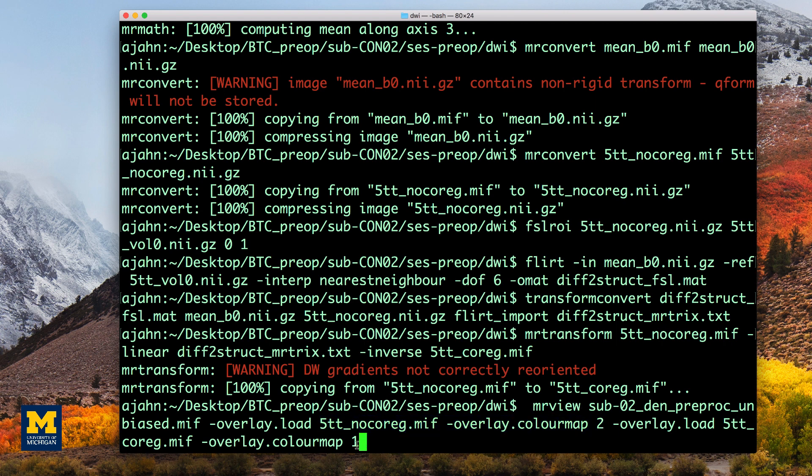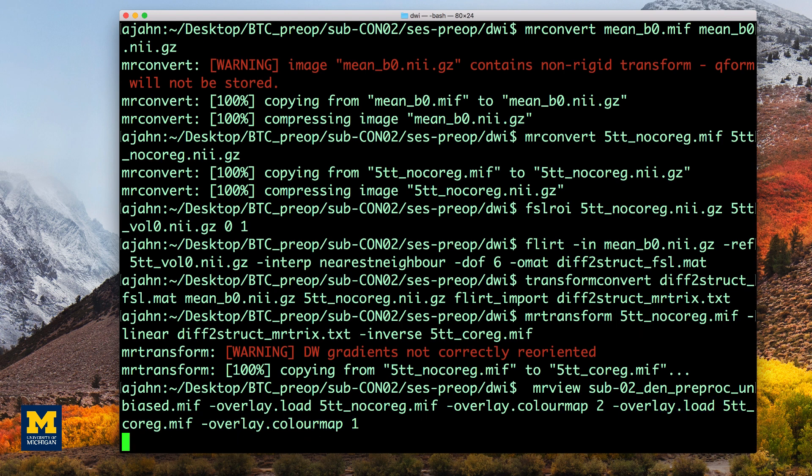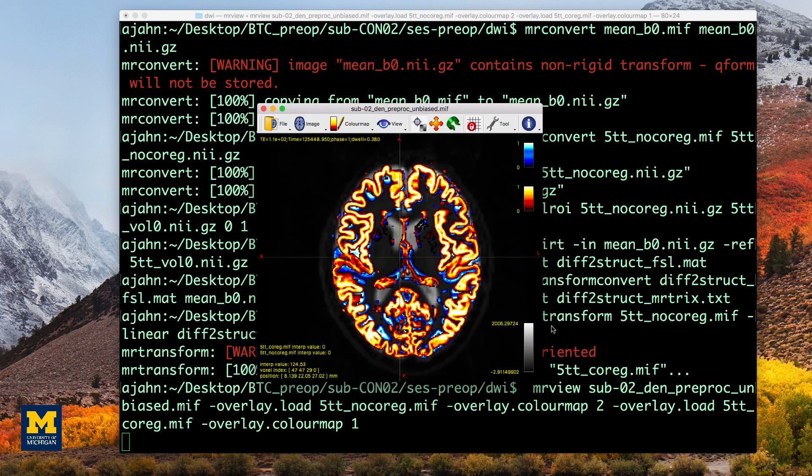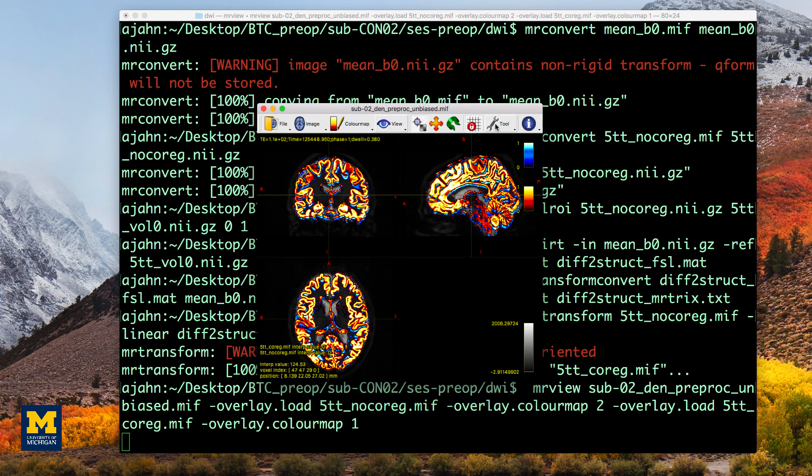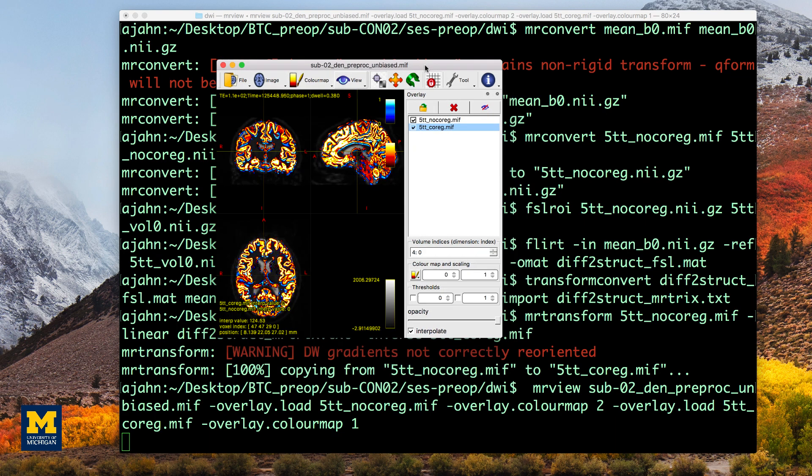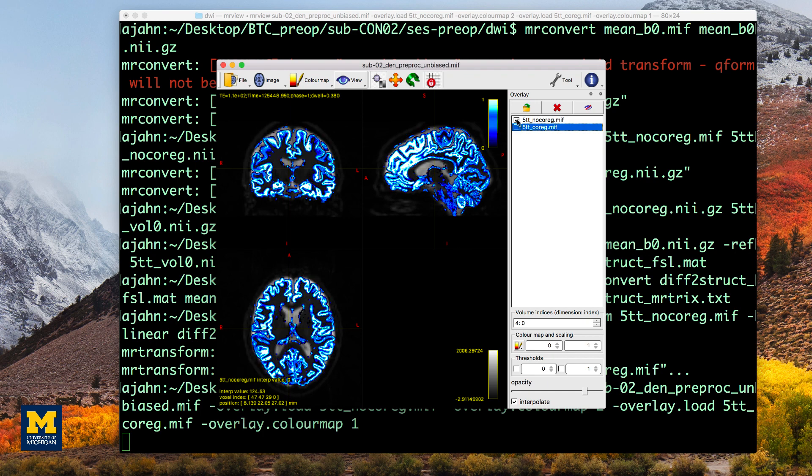And the boundaries after co-registration will be shown in red, indicated by the number 1. Make sure to check the boundaries in all three views. You can also use the tool overlay menu to display or hide the different overlays, as well as change the opacity of the currently selected figure.